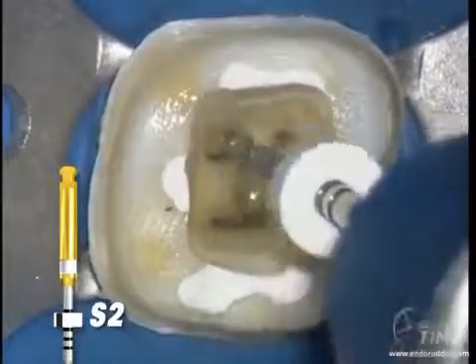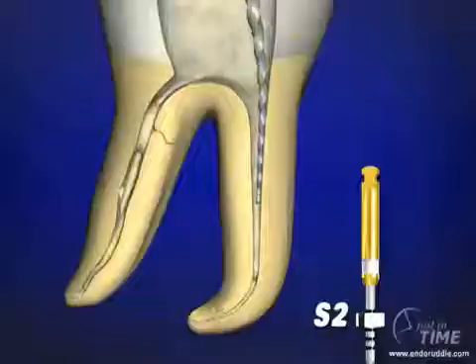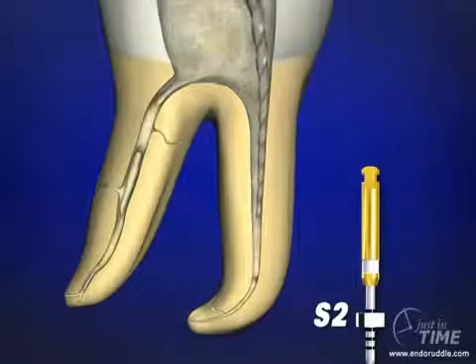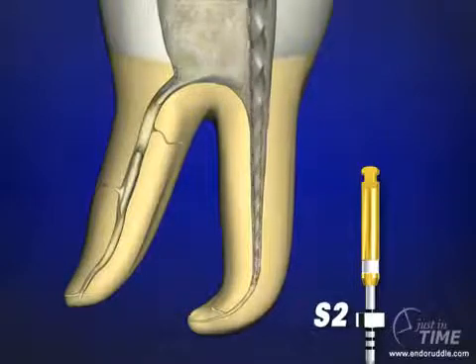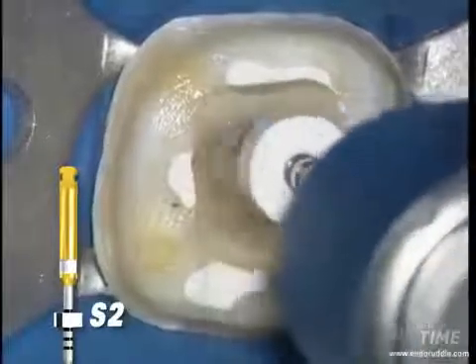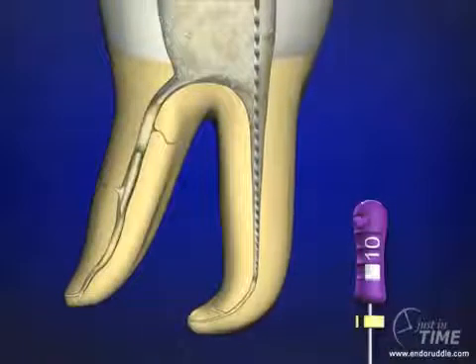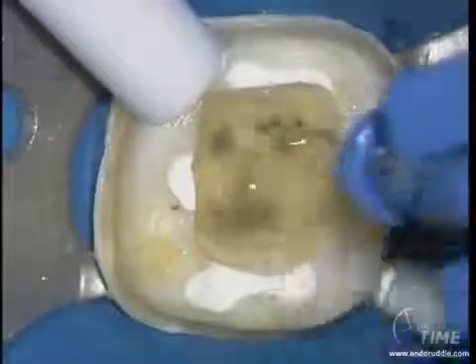Float into the canal, and before resistance, begin to brush — brushing away from areas of furcal danger. Brushing makes lateral space and allows the bigger Eiffel Tower blades to progressively cut and engage dentin more down into the middle one-third of the root. Once the rubber stop has reached the reference point, our work is done and we have optimally pre-enlarged the coronal two-thirds of the canal. Notice all the debris in the pulp chamber. The reminder is: after every rotary, irrigate, recapitulate with the 10 file to maintain the glide path, break up debris, move it into solution, and then re-irrigate to liberate that debris.